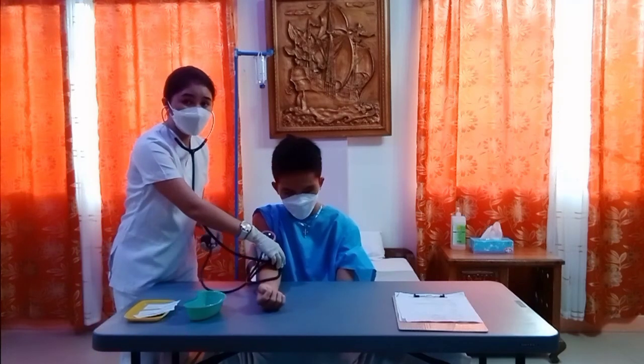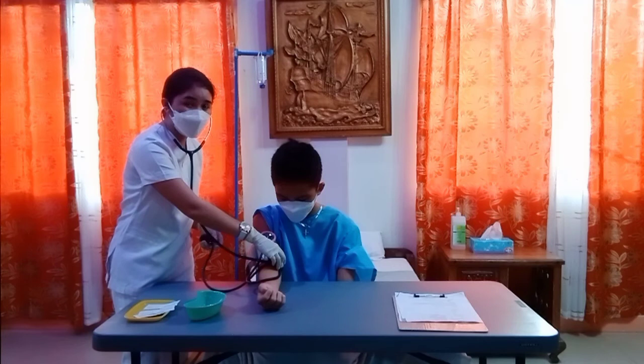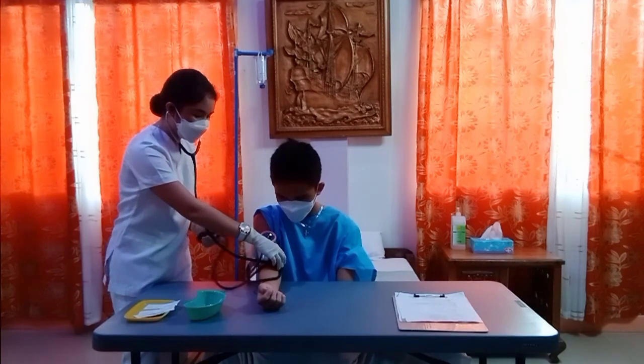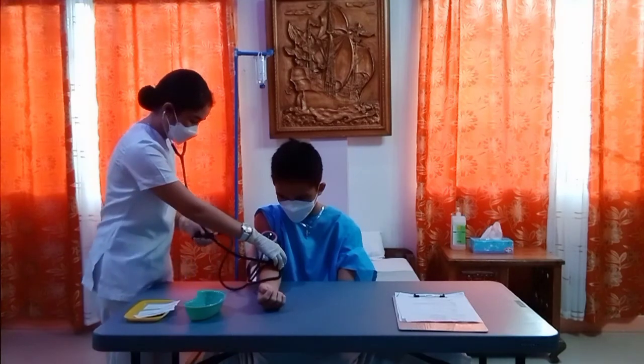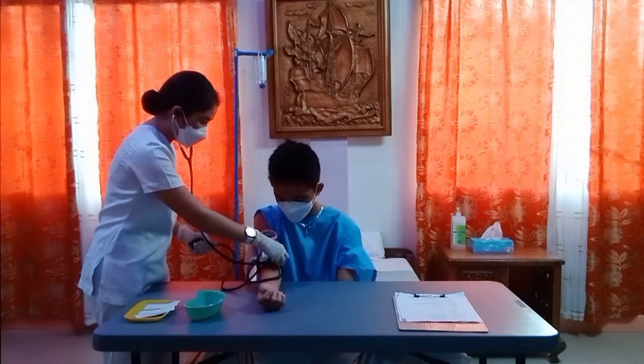Next is to use your dominant hand to close the valve and pump to inflate until manometer. Using your dominant hand improves dexterity. It will make it easier to handle the valve and pump the cuff to attain a more accurate blood pressure reading.